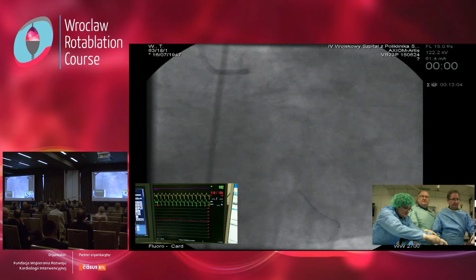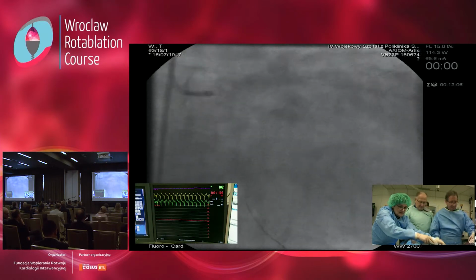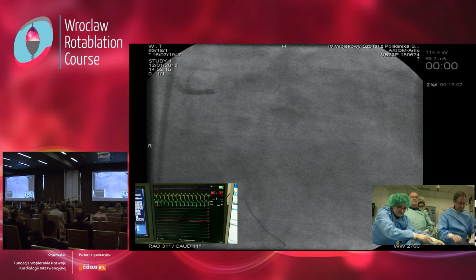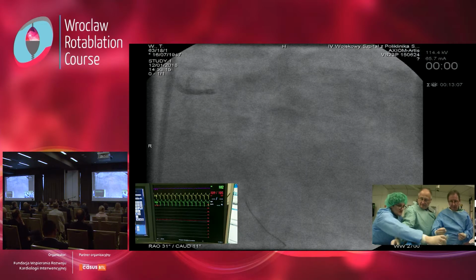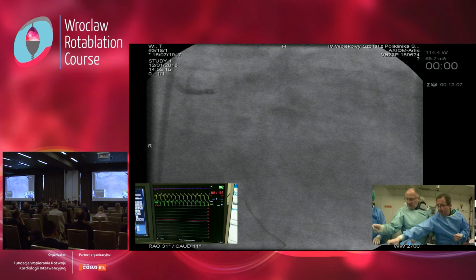I have a proposal, Mirek, yeah. Georg, because we are behind the schedule and have still 3 cases to present. Okay, we just leave you with the circ, you will work, and then you will show us the final result. Yeah, that's a good idea. We just go. We need a few minutes still. Okay, balloon.